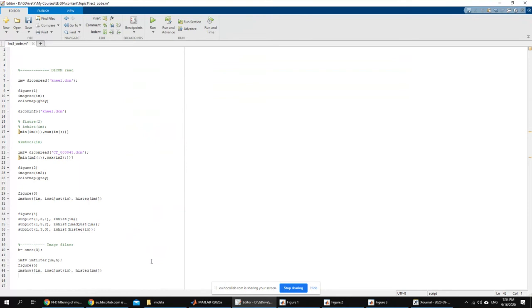Let's display it the way that I showed you here, using image show with the other ones. But we have a problem here in that the adjustment has to be used. So let's adjust both, just to be sure, the first and the second. As we saw before, the image didn't look good when we used just image show. We had to use image adjust. So I'm going to use image adjust for both the image before and after the filter. Okay, let's see what it looks like.